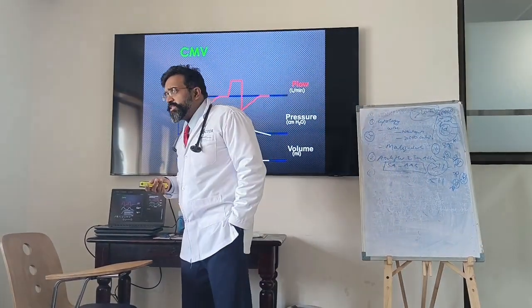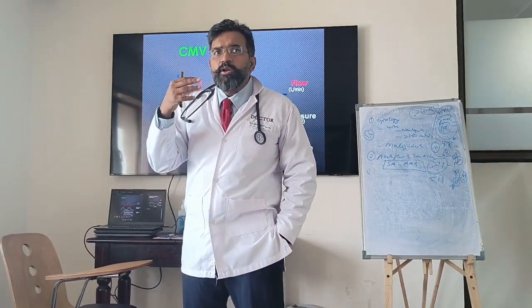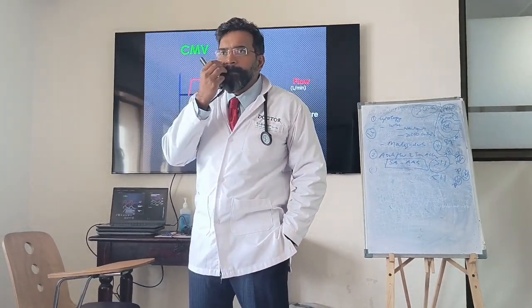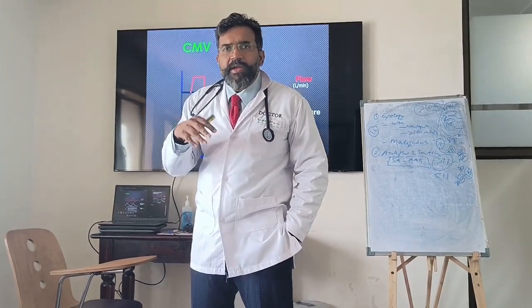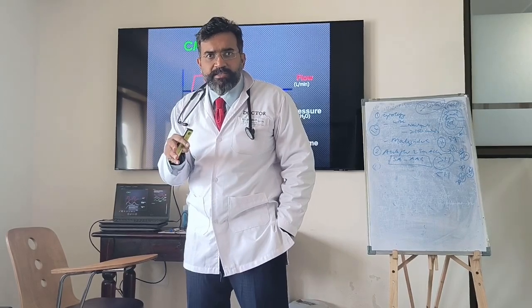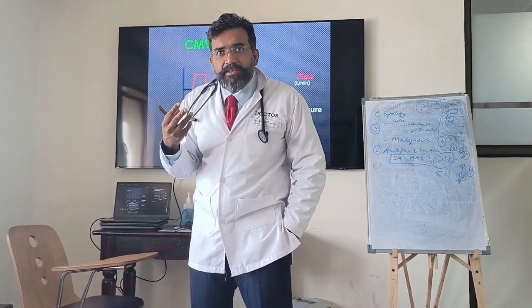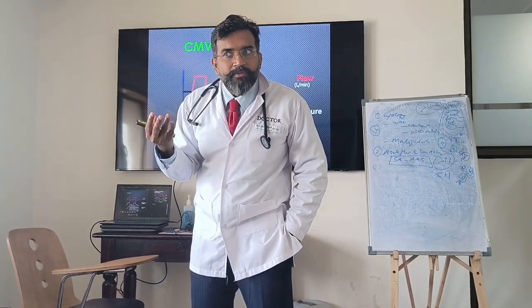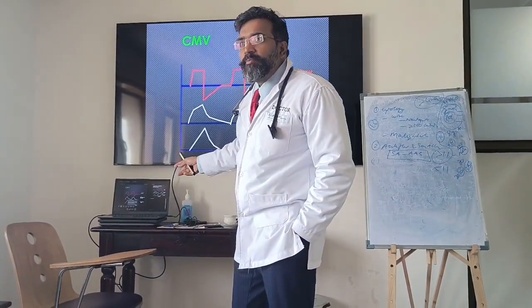Clear? Now, what did we first initially say? That these are positive pressure ventilation. That's why all your breaths are above the baseline volume. It's positive pressure. If it went below the baseline, it would become negative. Now, in a patient that is sedated and paralyzed, patient cannot take a single breath. If the patient takes a breath, where will the waveform go? Negative. Which waveform will go down? Inspiratory. Which waveform will go down out of these three waveforms? Pressure.